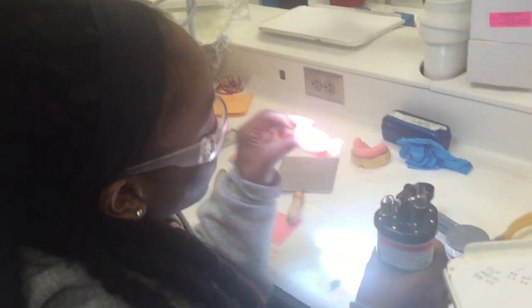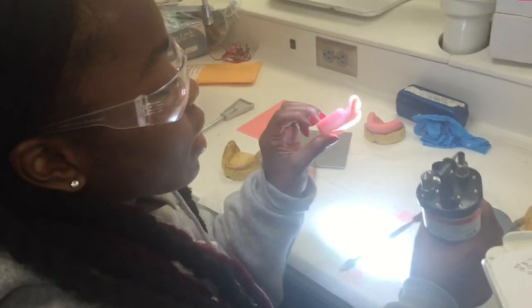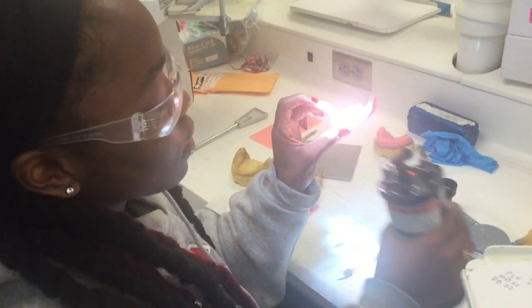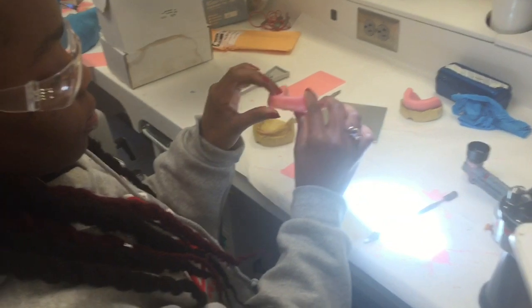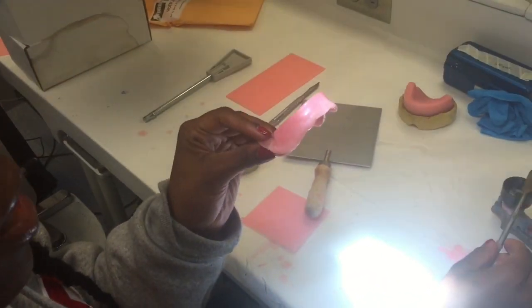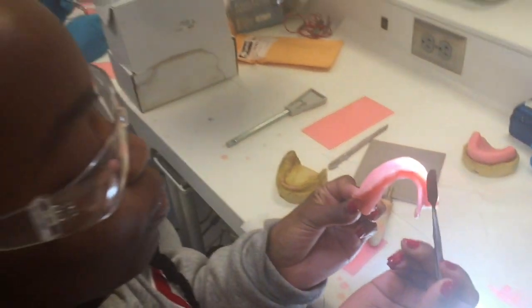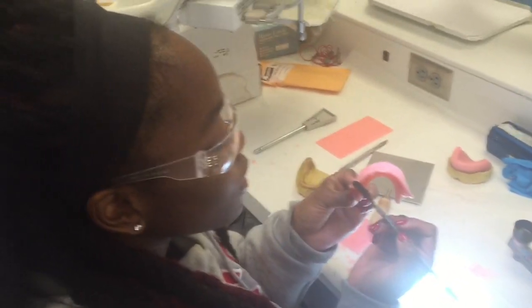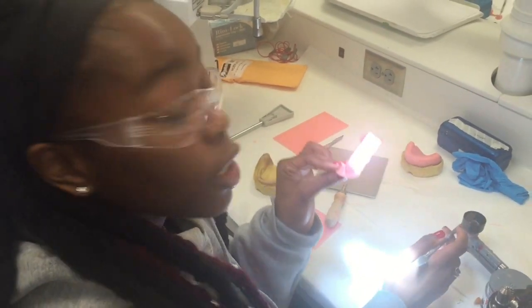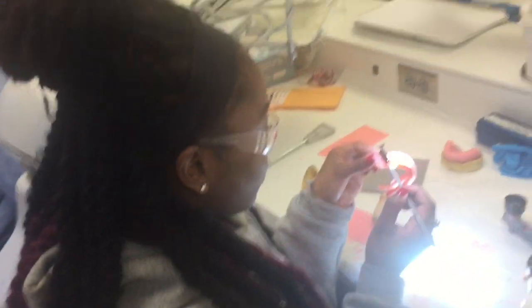What are you working on? I am working on my mandible. I'm putting my wax rim on my mandible. You want to make sure everything is very smooth and it looks aesthetically pleasing to the eye, so they can overlook all the bad things that's going on. All right, thank you, ma'am. No problem.